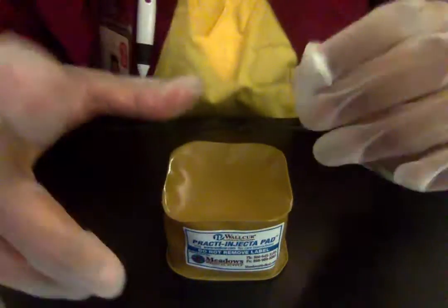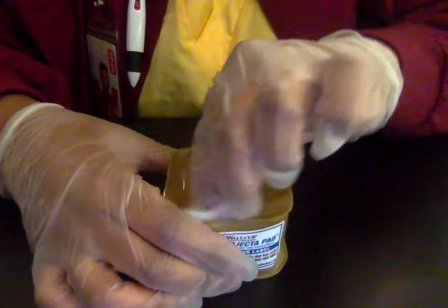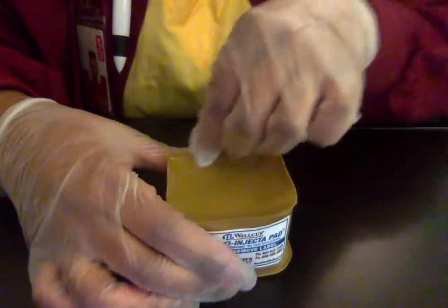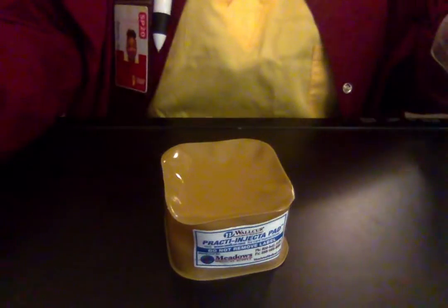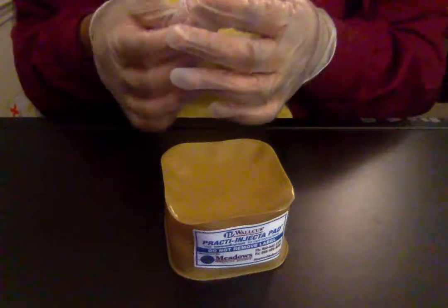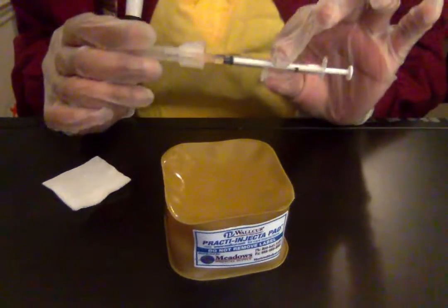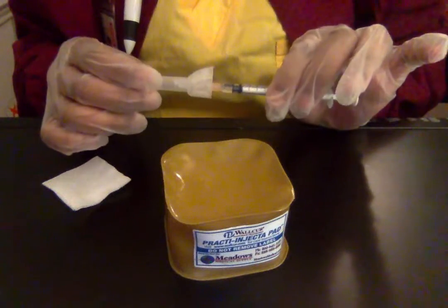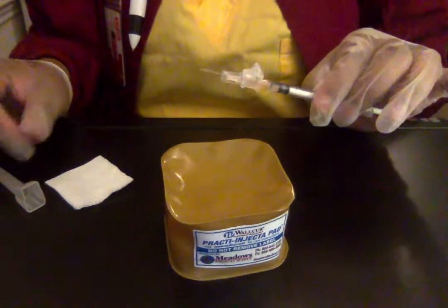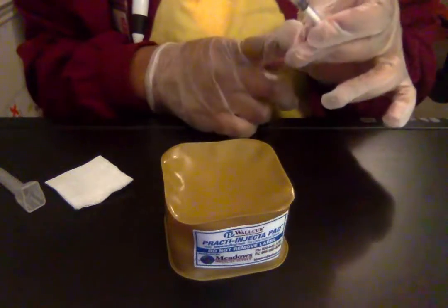So I'm going to first start with cleaning that area, and I'm just going to go inner to outer. That went over the same space twice. So now I have my needle here with me on some gauze. I've already had it pre-filled, so now I'm just going to go ahead and take the top off. And I want to make sure my bevel is up so that I know I'm inserting it.